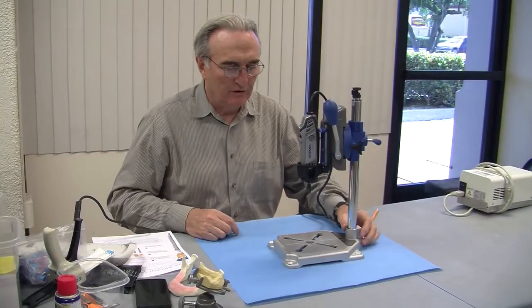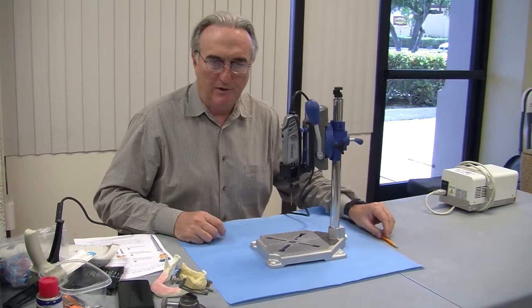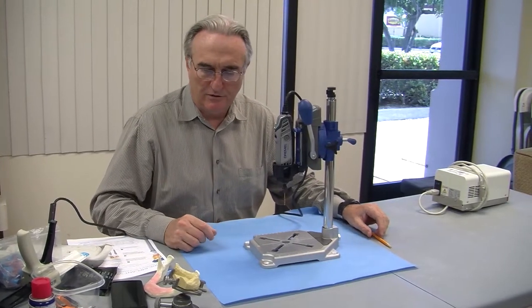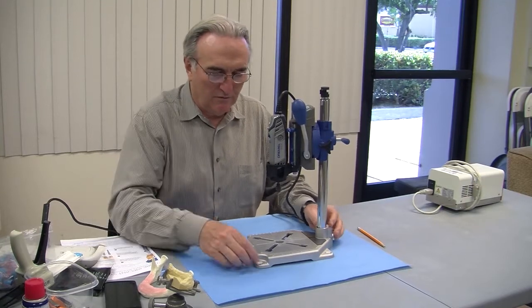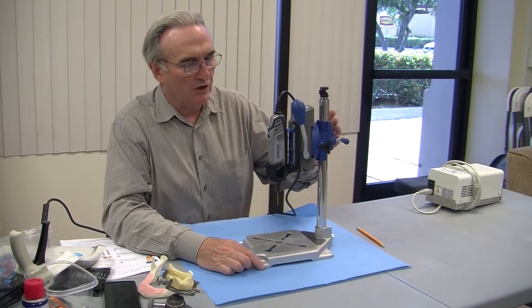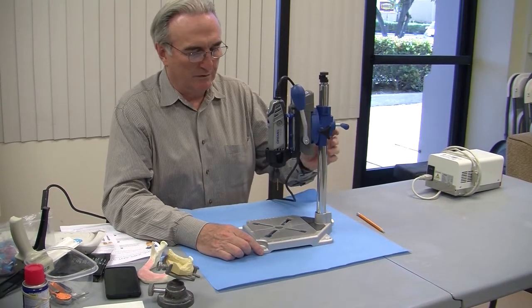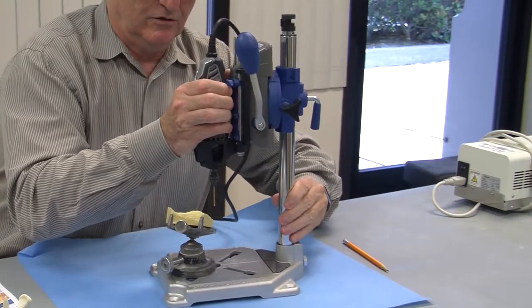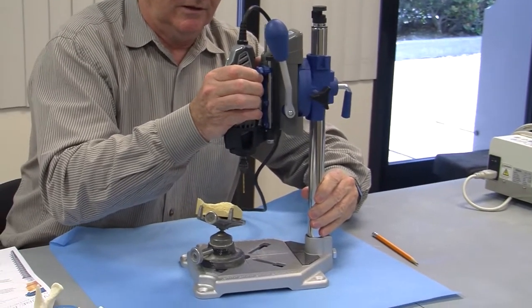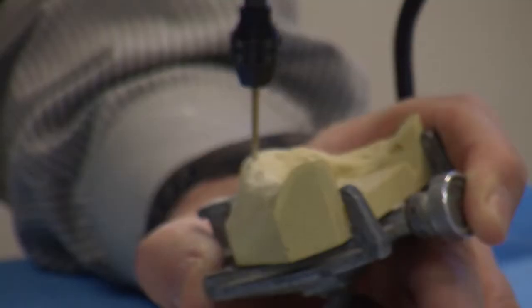In order to achieve a parallel placement of implants and parallel locator attachment placement, we are using a very low-end press drill by Dremel. So we adjust the height to be able to reach properly.